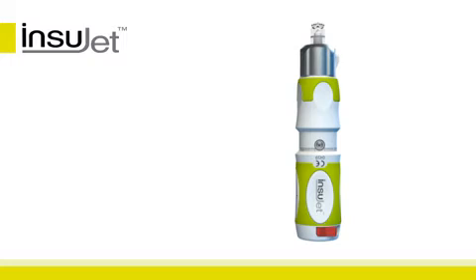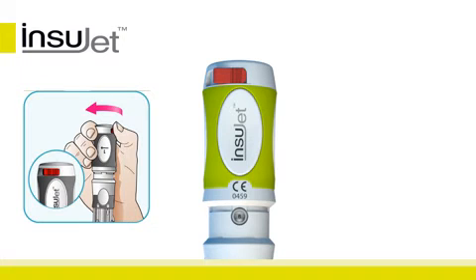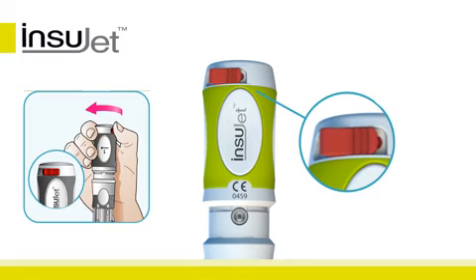The Insujet is now ready for insulin administration. Slide the red safety catch on the back of the Insujet as far as it will go and hold in place.